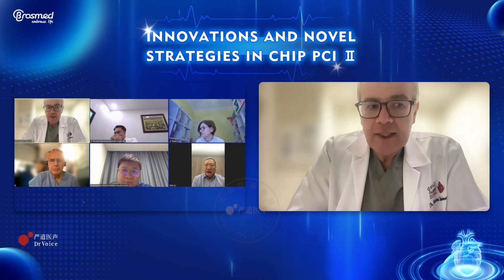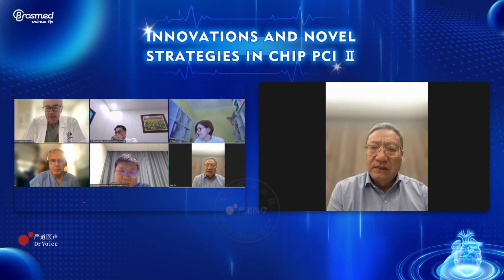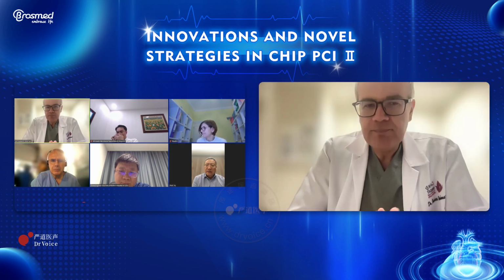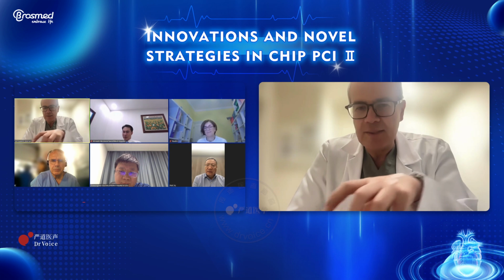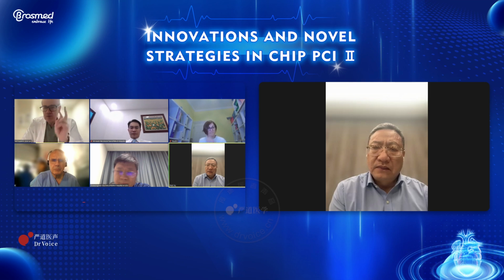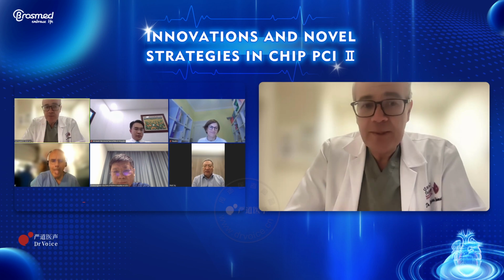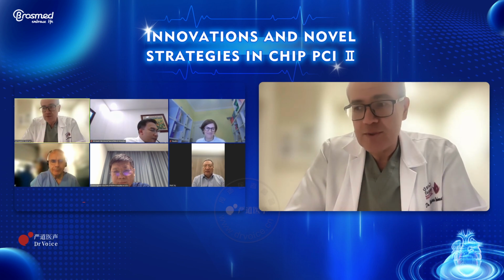Well, in our experience, more than 10 years using DCBs, we are speaking about the need to take the patient back to the cath lab within the first 48 hours. This happened to me twice in 10 years. Twice in 10 years. If I compare that to acute stent thrombosis, which I used to have.